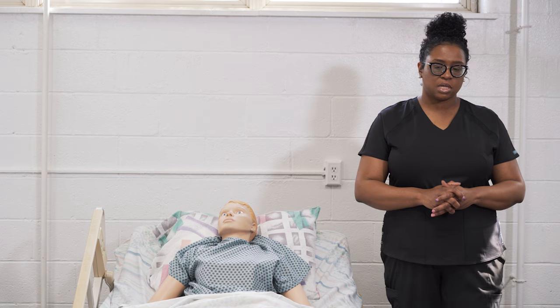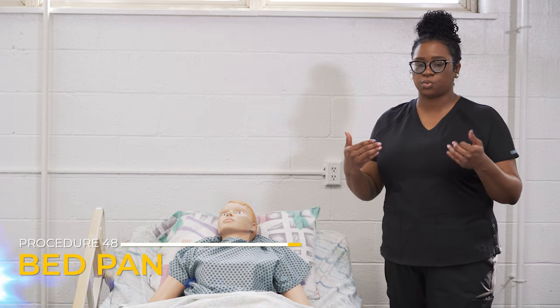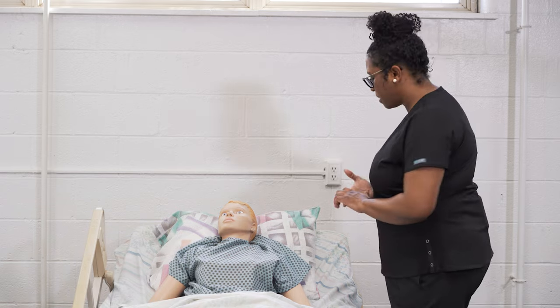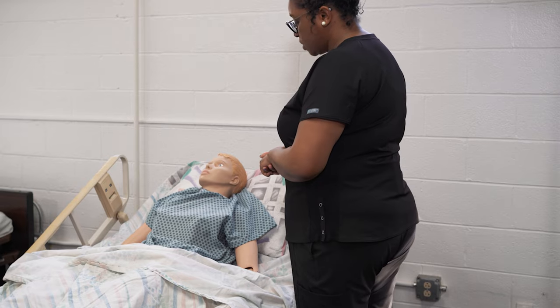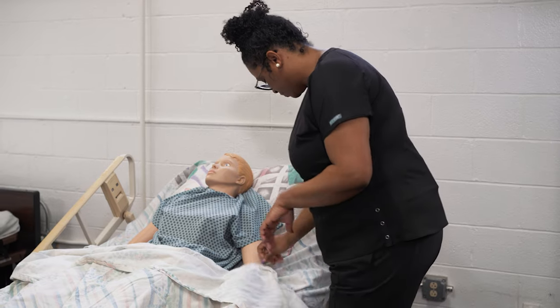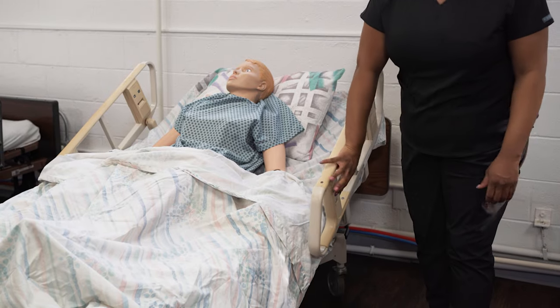We're going to start with doing initial steps. Remember, any procedure where the resident is staying in the bed, we're going to move the bed up to working height. Ms. Smith, my name is Brandi, I'll be your CNA today, and I'm going to help you to use the bed pan. I'm going to start by raising your bed up to working height, which is going to be waist level.